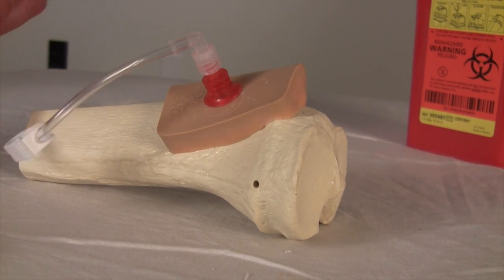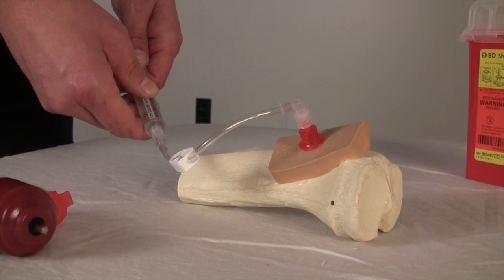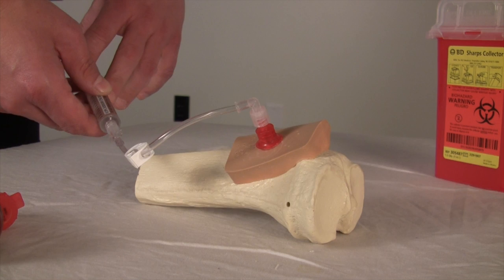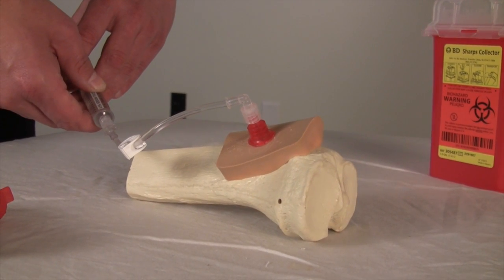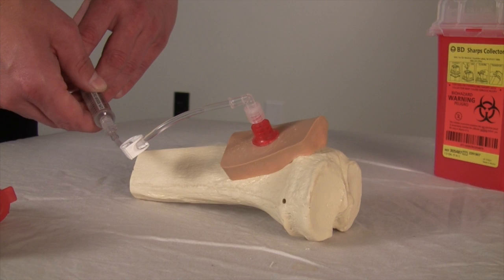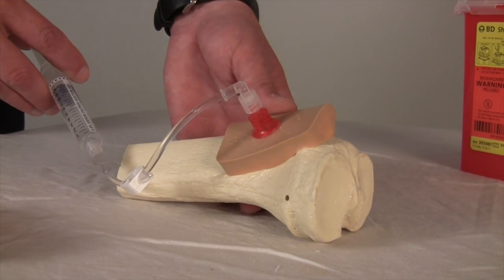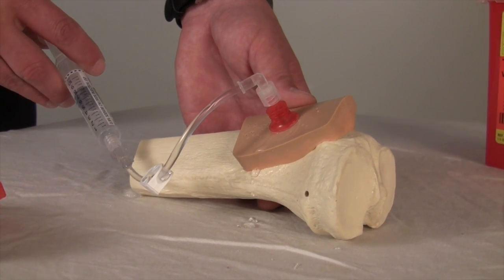A syringe is placed on that tubing and is pulled negative. In some situations, you'll get bone marrow or blood back into that syringe. If you don't, it does not mean that you're not in place — it simply means that you're not aspirating through the needle. The needle should be flushed, and once it is, it can be used for anything that you can give IV.